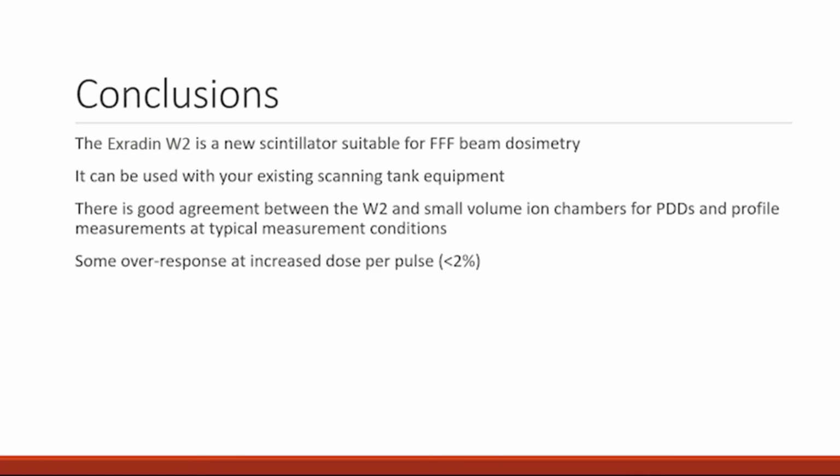As long as you have the two configurations, the max and the min configurations, the only thing that would change is the amount of stem irradiated, but it shouldn't depend on the field size that you actually use. It's a good thought to try it with the dose rate and see if that affects it. But no, we didn't. We only took it once.